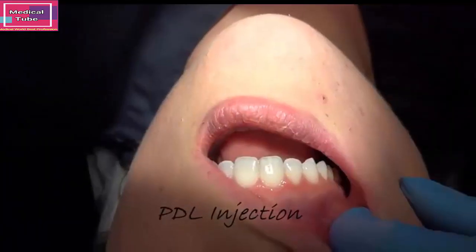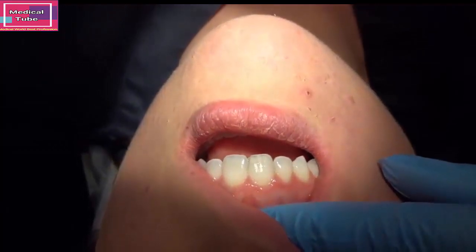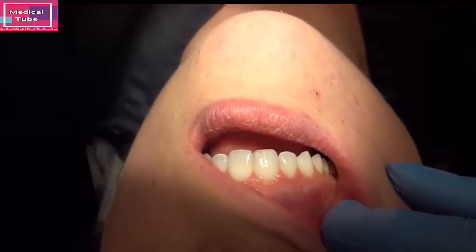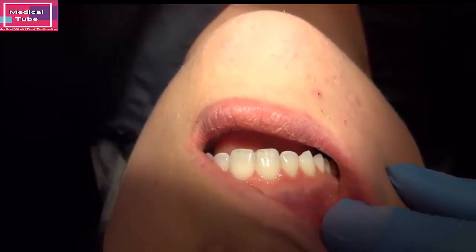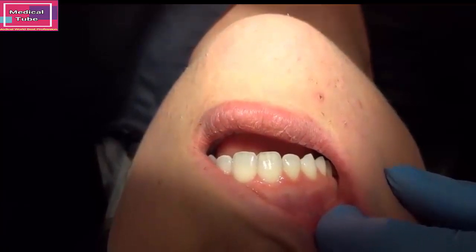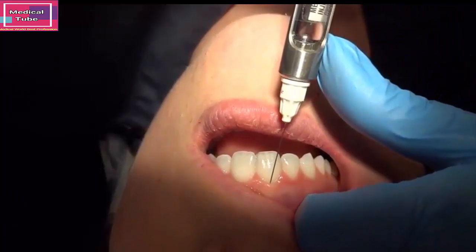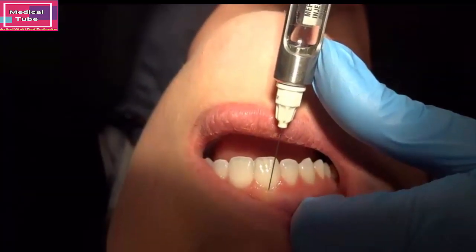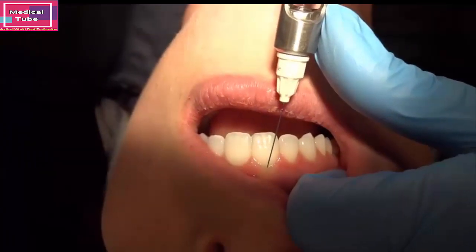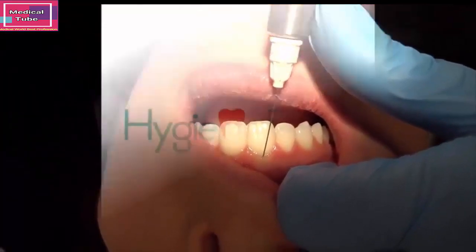There are also times when I've given the patient an ASA in this area and a local infiltration in this area, and there's one spot that is still not numb. I'll actually insert it, just like I would my probe, into the base of the pocket, and insert into the junctional epithelium, and it'll look like this. And you just deposit until it blanches white, which is only a few drops needed.